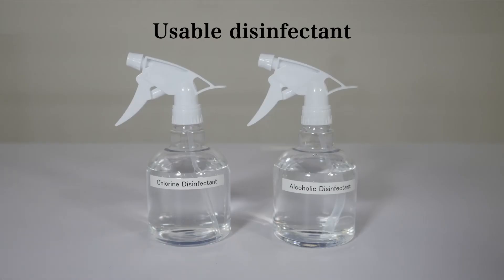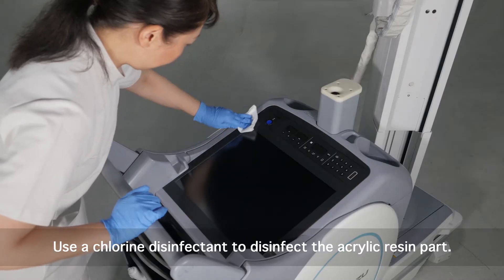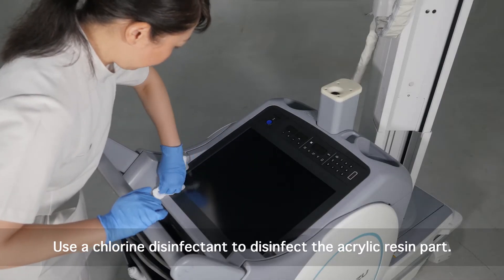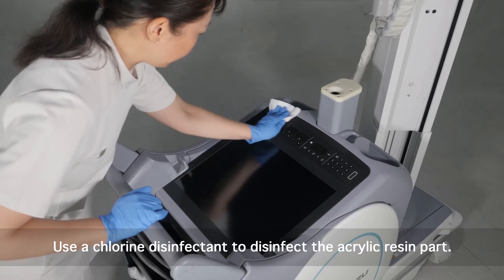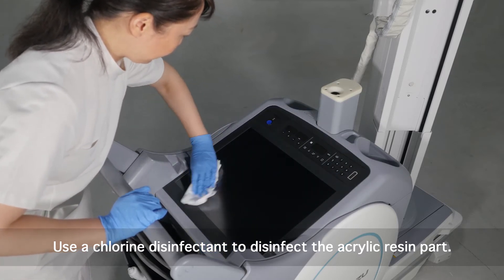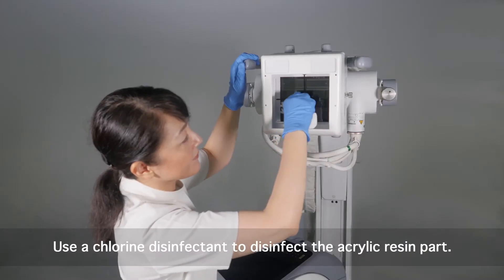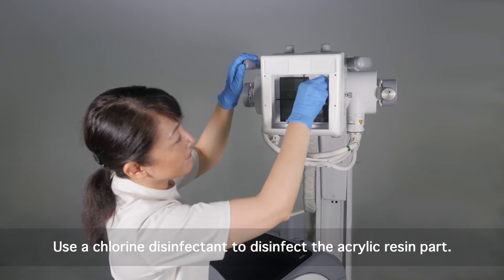These are the available disinfectant agents. Wipe with a cloth lightly moistened with a disinfectant. Use a chlorine disinfectant to disinfect the acrylic resin parts such as the touchscreen and the front transparent resin part of the collimator.